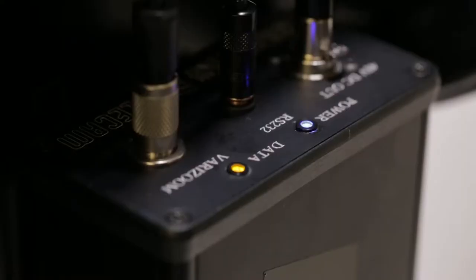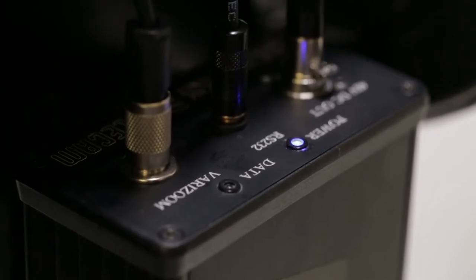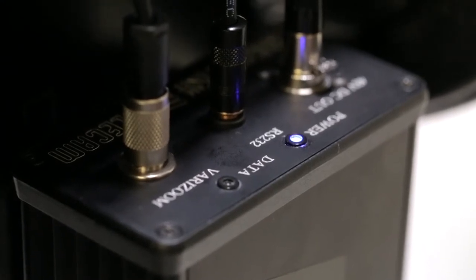Once booted, you should see a blue light and a solid orange data light on the interface box. The orange light will start solid and then flash rapidly before turning off. The light will then flash when commands are being sent to the camera from the VariZoom controller.